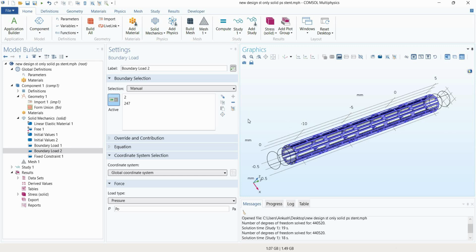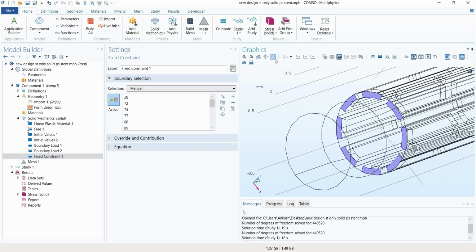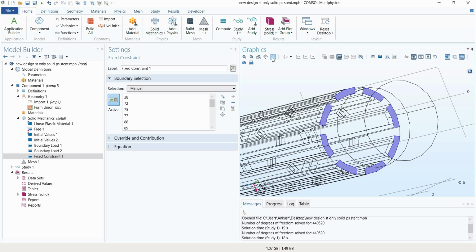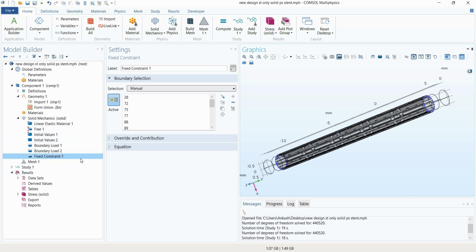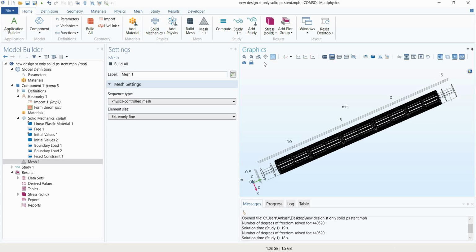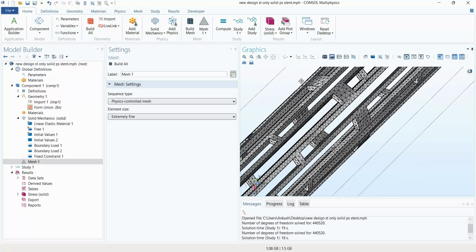For the fixed constraint we have selected the end faces, as you can see here, this and this. So we have followed all the conditions which we mentioned earlier. Now in the meshing we selected extremely fine and clicked on build all. Then we got this meshing. This is not looking good... yeah, this is good now. As you can see here, this is the meshing of the stent.